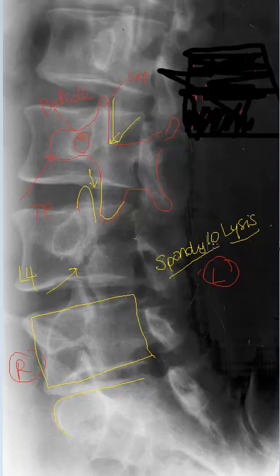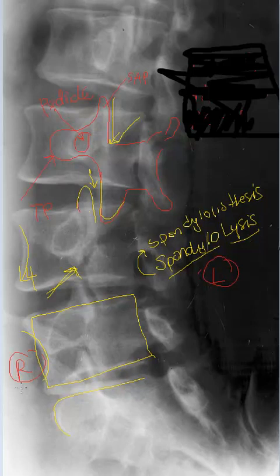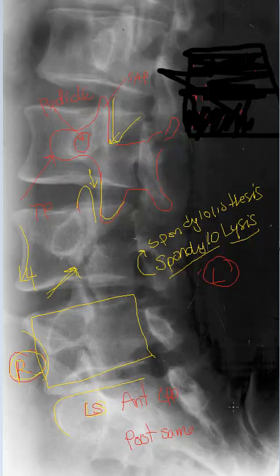These defects can lead to slippage of the vertebral segment, which we call spondylolisthesis. When pars inter articularis defects lead to vertebral body slippage, we call it spondylolytic spondylolisthesis. Without the lateral projection it is difficult to tell if this patient's vertebral segment has slipped. I suspect they have not, as the anterior margins of the vertebral bodies above and below are lining up quite nicely. In the lumbar spine, anterior obliques show us the opposite side and posterior obliques show us the same side, meaning this was either an RPO or an LAO.